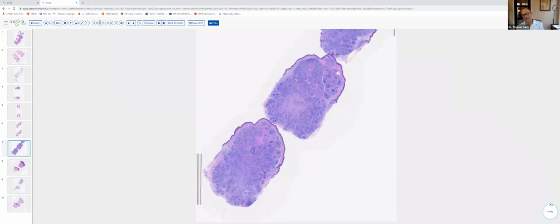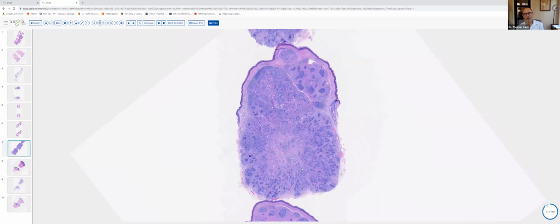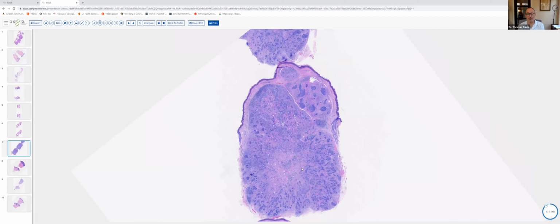Slide number 7, I think, is a very pretty tumor. It's one of my favorites. And one can see we have a very vertically oriented neoplasm here in the dermis. This actually, I think, resembles a pillar or a pillar-type candle. And as we move to higher power, again, it's important to assess architecture. We can see that this proliferation is very well circumscribed, vertically oriented, and symmetric. One half looks like the other, so it does have a benign architectural configuration.